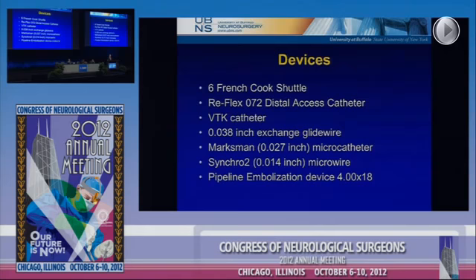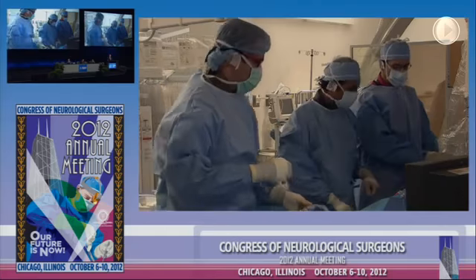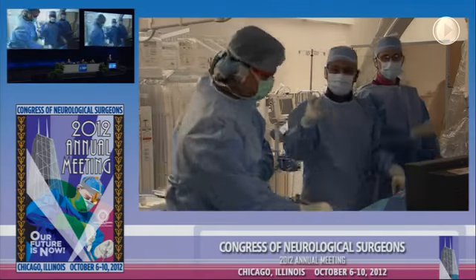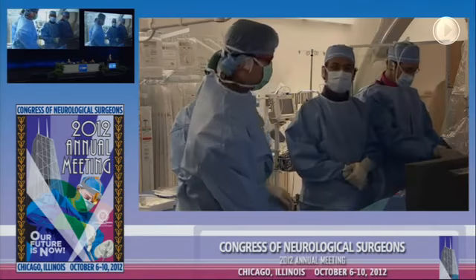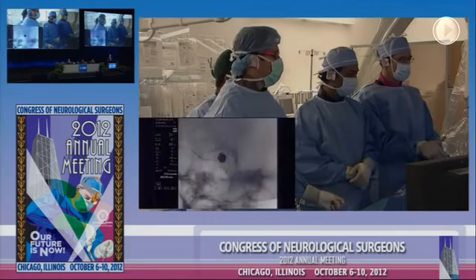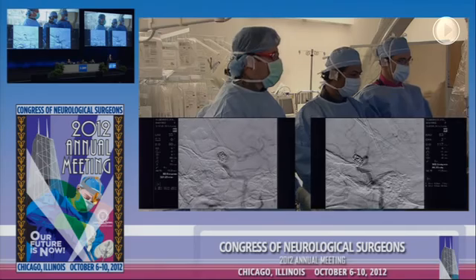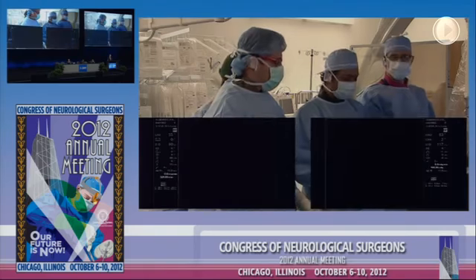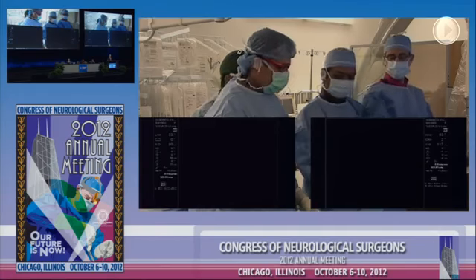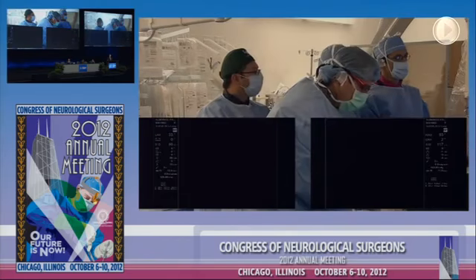And as Travis said, there's a good dome protection of this aneurysm, but the base of the aneurysm is very wide and incompletely treated. And we can't leave that base unprotected because this is a ruptured aneurysm and will recanalize. Okay, so let's get a roadmap off of that, please. 100% contrast, please. Tell us your rationale for why you coiled it initially, guys.